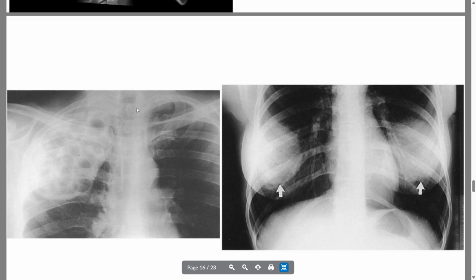And if you have somebody who's older, or you're working in a VA, or working on somebody that's pretty elderly, they may have had this procedure done. It's called the plombage. So if you're ever doing a chest and you see this characteristic thing, and it's always in the upper lobes, it's where they used to do a treatment for tuberculosis about 50-ish years ago, where they inserted a bunch of foreign bodies into the lobe that collapsed.